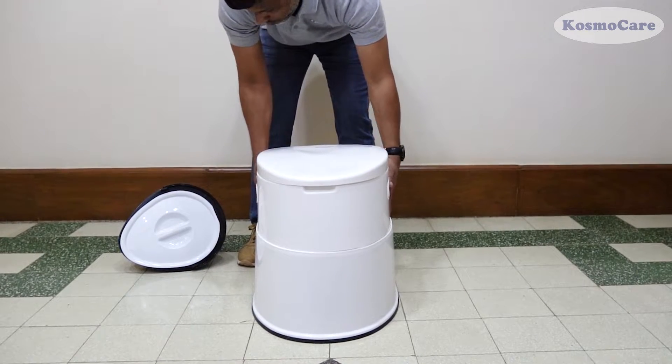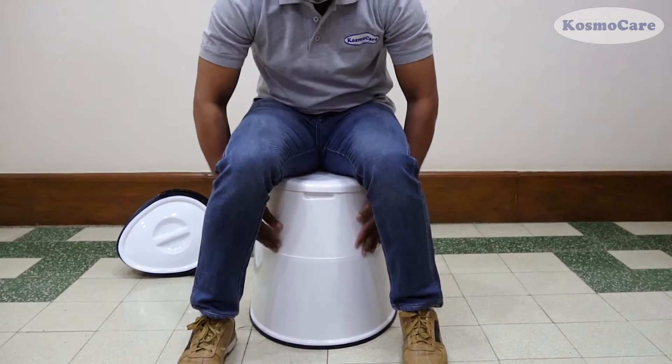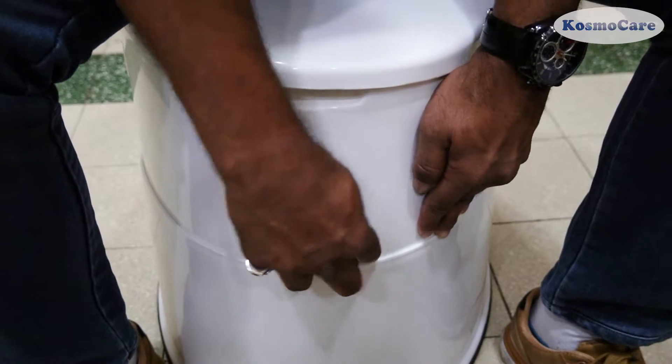To lock the components in place, sit on the commode to gently apply some pressure and press the upper section of the commode inward, until you hear a click sound.